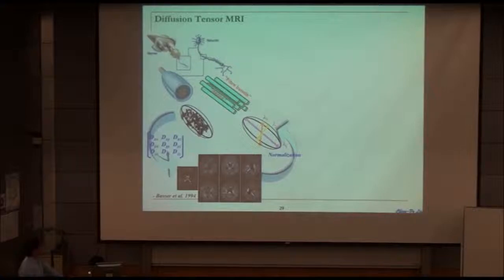Then we can get the ellipsoid model from the tensor. We can see there are 3 directions, one along the track direction and two perpendicular directions, and also 3 values. The values mean the diffusion coefficients along the different neural directions.